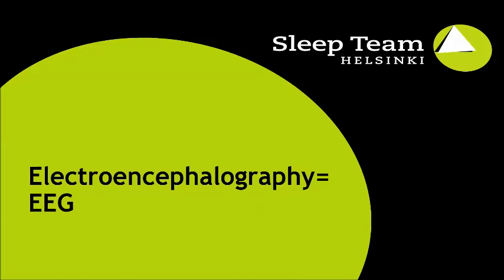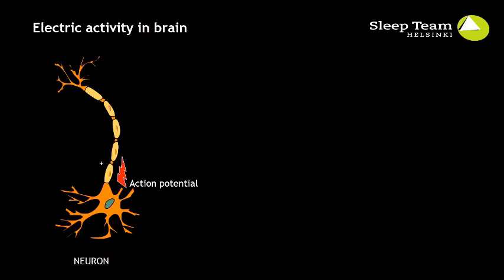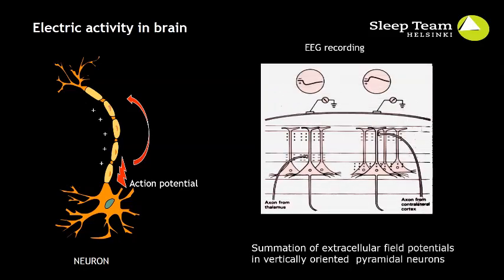Electroencephalography is a measurement of brain electric activity in humans measured outside the bony skull. Activity of neurons creates low-voltage electric activity around neuronal networks. When activity of thousands of neurons is summated and amplified, the activity can be recorded also outside the skull.